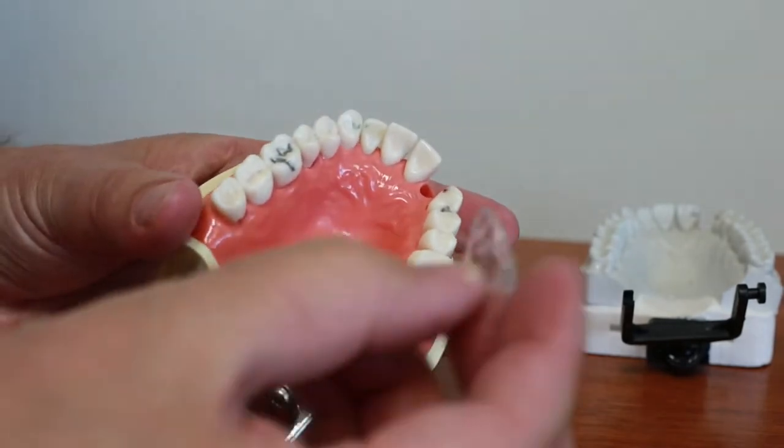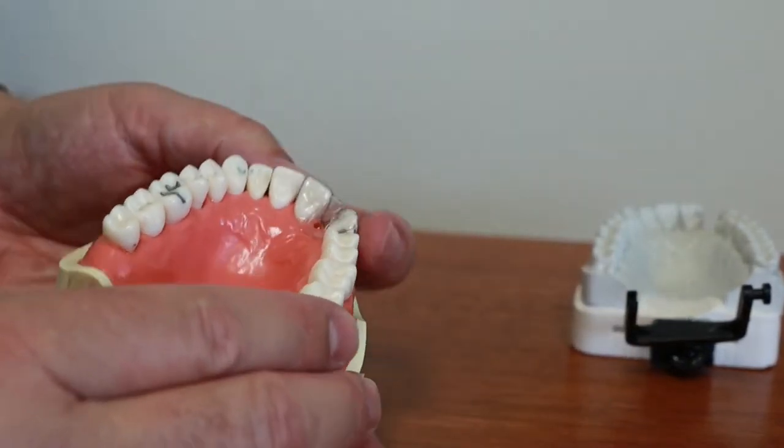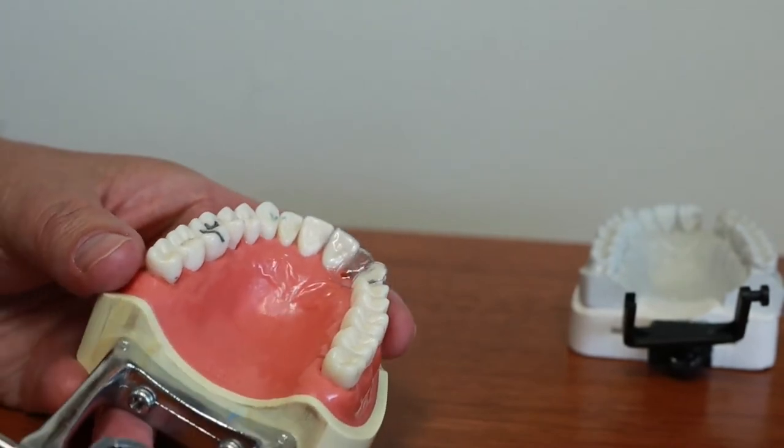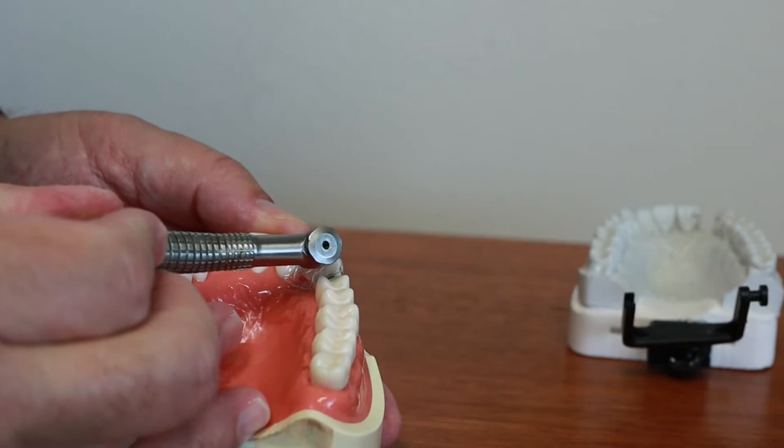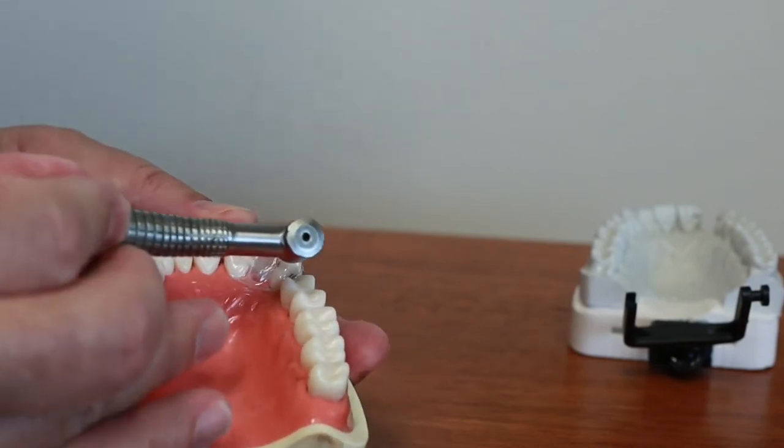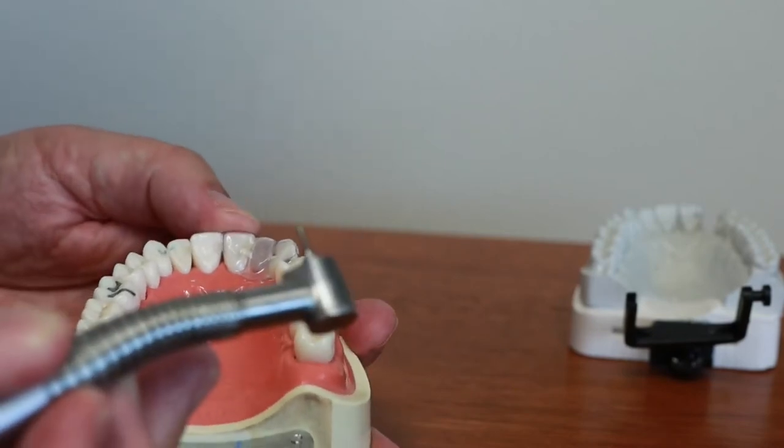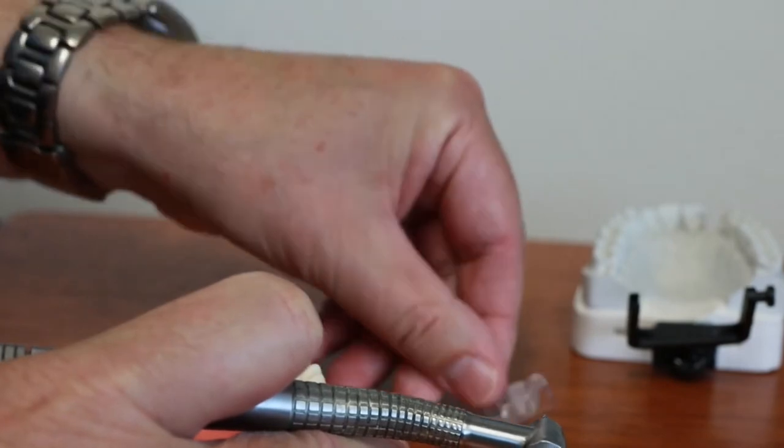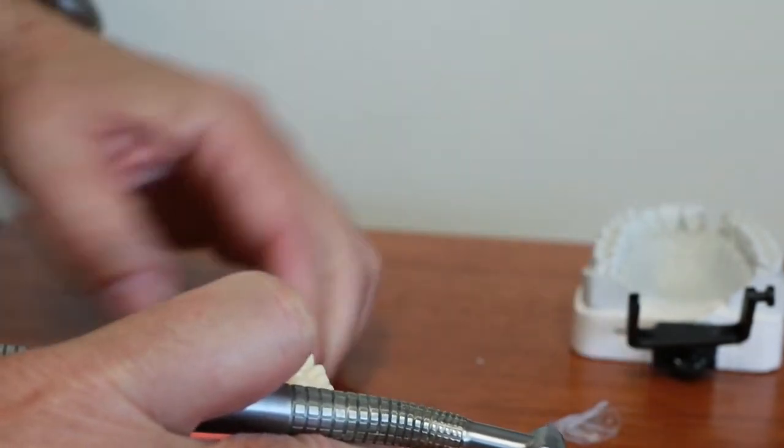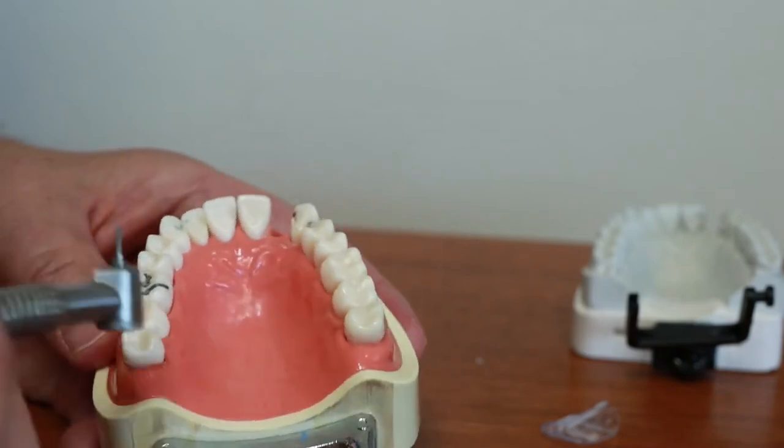First thing you do, you take the prep guide, seat it on the patient. And then those two little holes that are in the prep guide, that's where you just make little dimples on the teeth. And what that does, that just marks the spots on the teeth where the bridge is going to sit. The smell of burning ivorine, that sort of brings me back to dental school. The teeth, Buster's teeth, are made out of a type of plastic called ivorine and it's got a very interesting smell when you're drilling it.